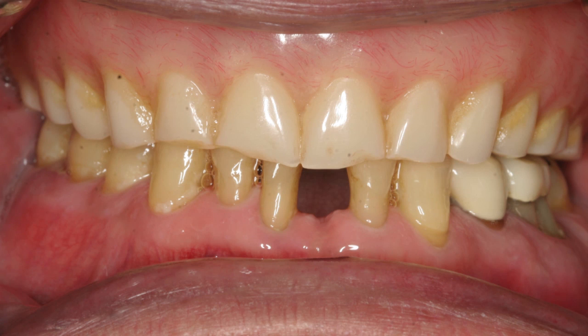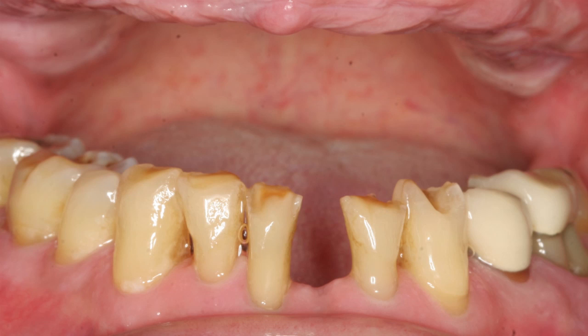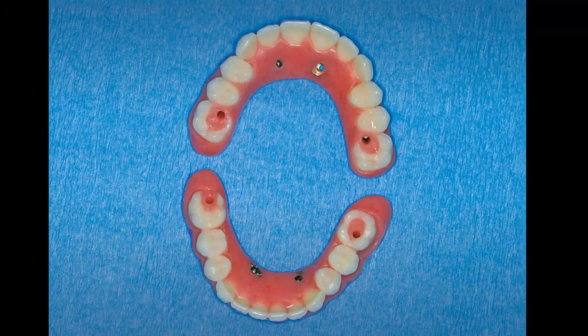The patient's unusual chewing stroke led to aggressive wear on his traditional upper denture, as well as the opposing dentition, which were deemed non-restorable. In addition, there is very likely evidence of parafunction. Such issues can become evident during the wax setup process, or as the patient wears their temporary appliance following implant placement. Following implant placement, temporary appliances were produced.